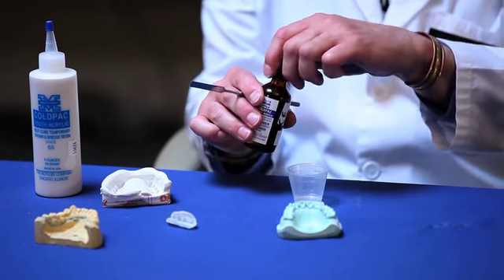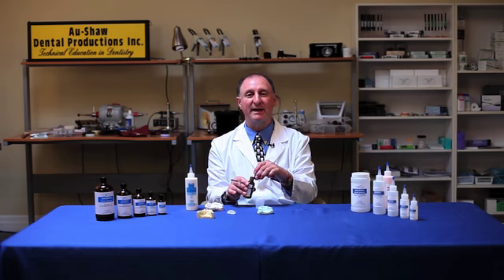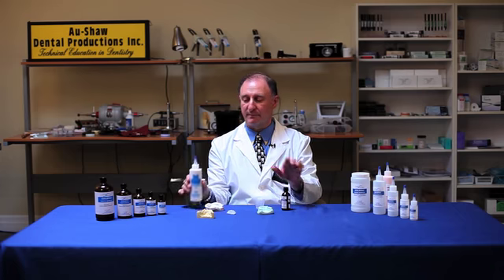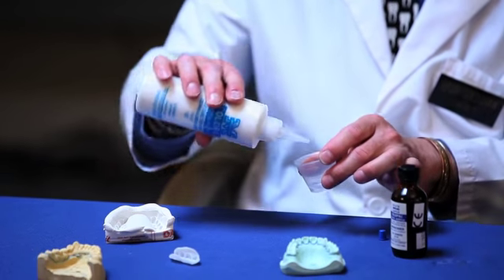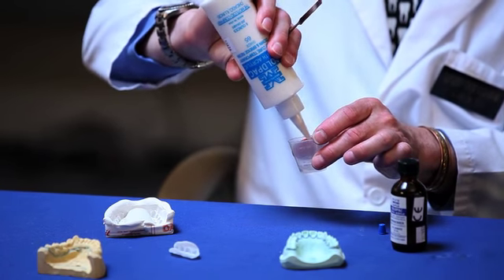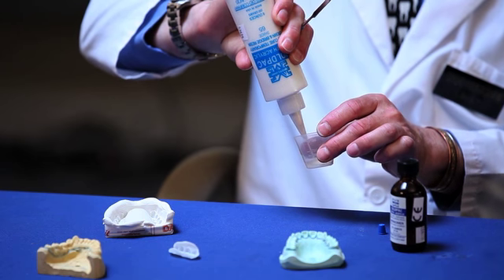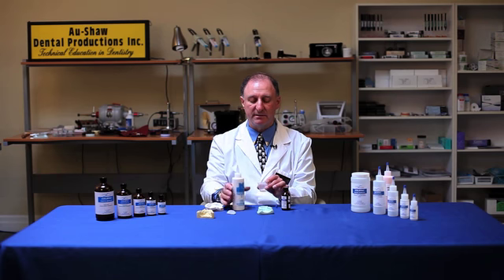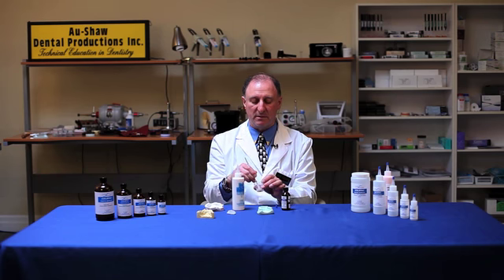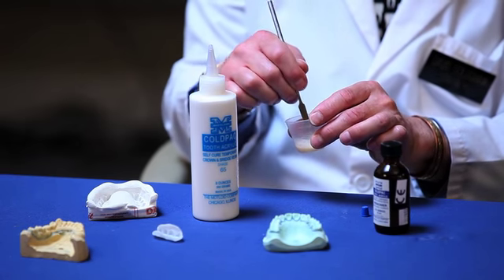First off, I'm going to pour a small amount of the liquid, the monomer, into a mixing vessel and then add our acrylic. With the special dispensing tops that we have here, we're able to put out just a small amount of the material and then apply that into our mixing vessel until we have the required amount. This is normally done by hand-eye ratio, and it's easy to mix. Once the material has combined together, we then apply the materials until we have a nice consistent mix.